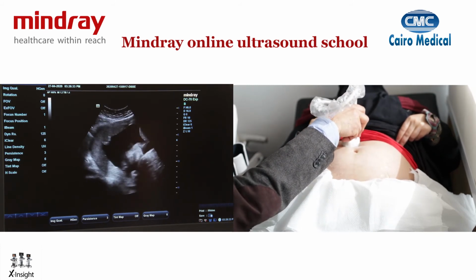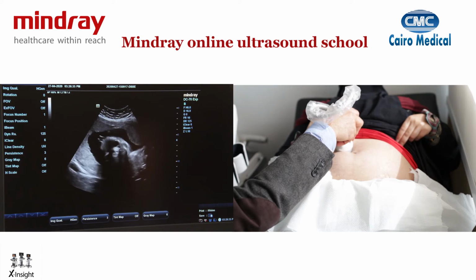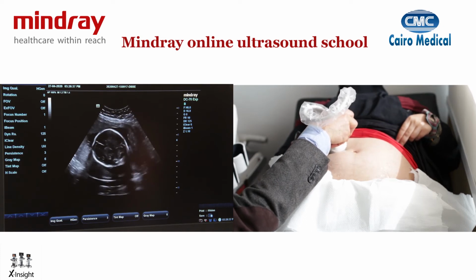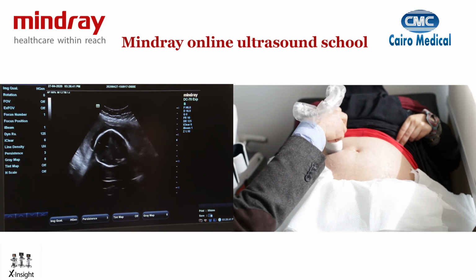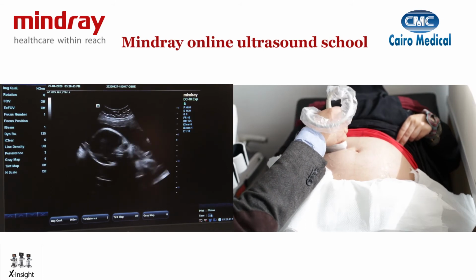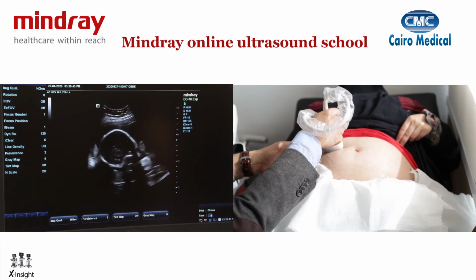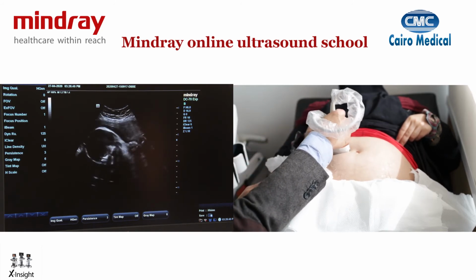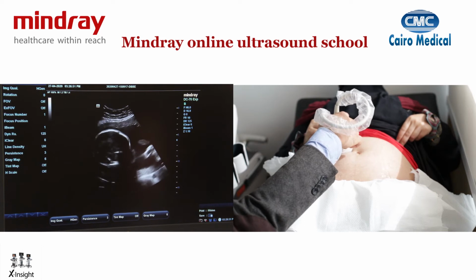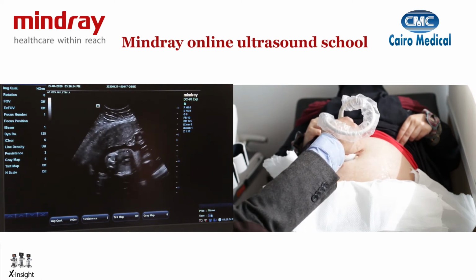The first point is I'm going to put the probe longitudinal, touching the abdomen at a 90 degrees angle. I'll find the midline echo of the baby's brain. I will rotate the probe at a 90 degrees angle, keeping my thumb on the right hand side so I can see on the frame here that the right is right, so my orientation is correct. And then I'm going to slide across the baby's abdomen.